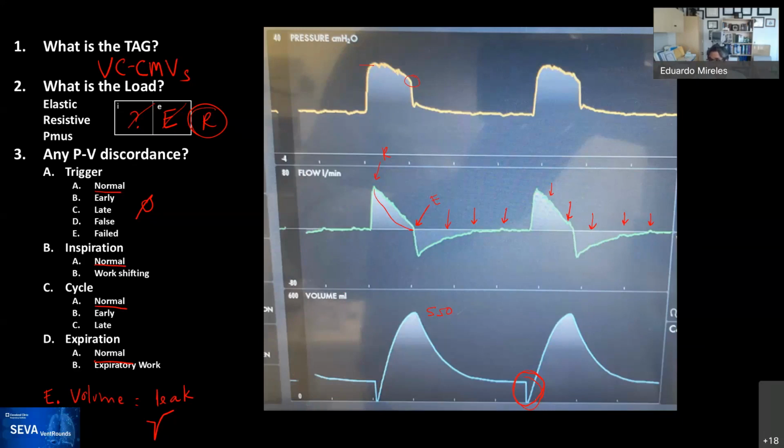I think I would choose volume myself, just because I think more of that being an asthmatic patient rather than COPD is when we truly get in trouble. I would just have more control. Regardless of the rates that I will have to use for those patients, if it's a truly bad scenario of dynamic air obstruction, then I will eventually need to drop the rate so much that the patient will be uncomfortable regardless, and most likely would need to be deeply sedated. So the more comfort of pressure wouldn't matter much here.